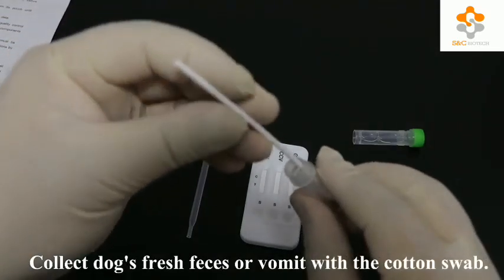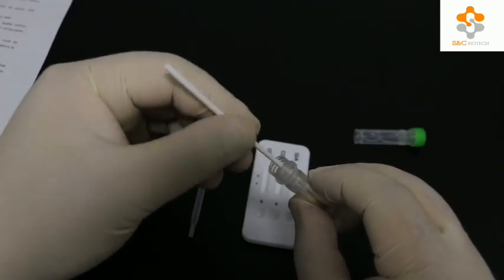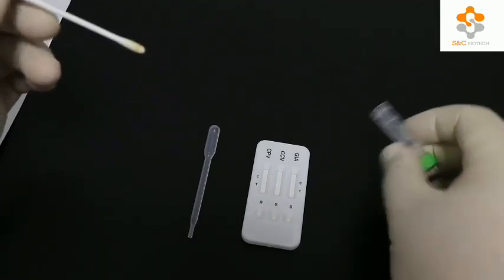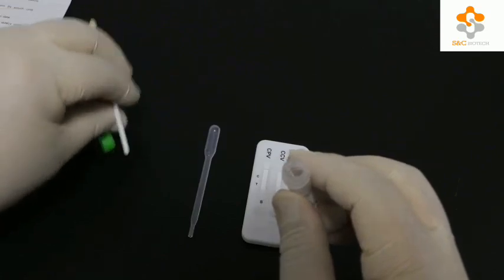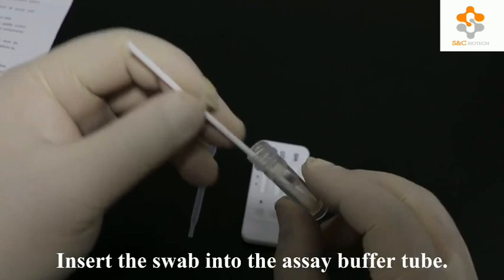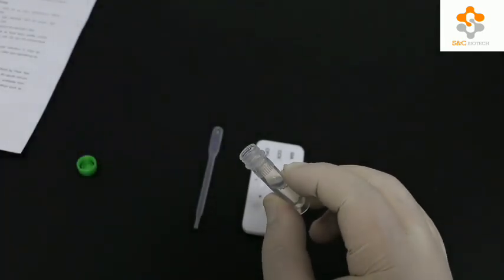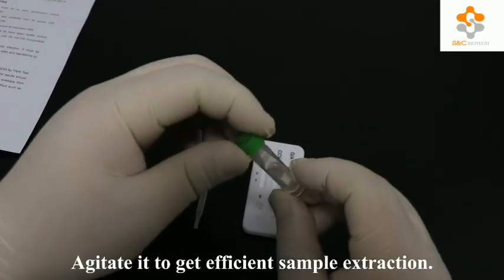Collect the dog's fresh feces or vomit with the cotton swab. Insert the swab into the IC buffer tube and agitate it to get efficient sample extraction.